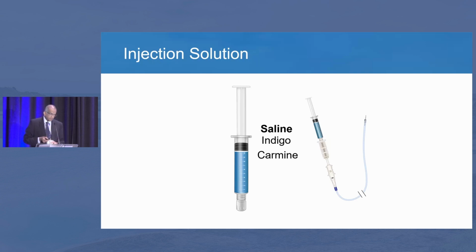that can happen, because that makes it very difficult for the next guy to cut. And when I use saline with indigo, I want to see that I can see the markings on the backside of the syringe if I look up. So that's the sky blue color you want to get.